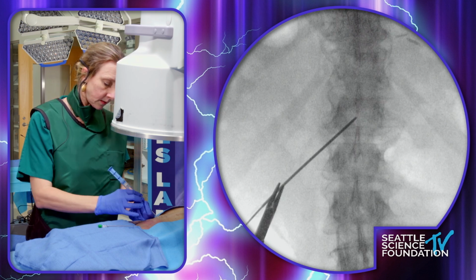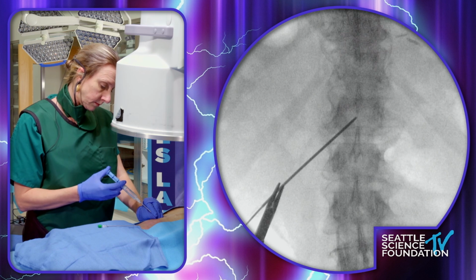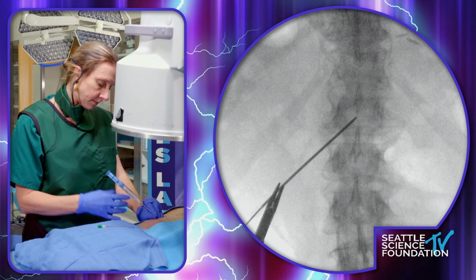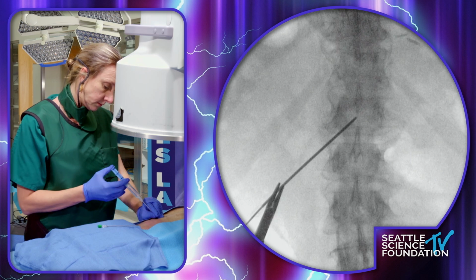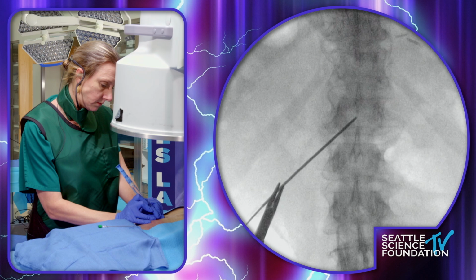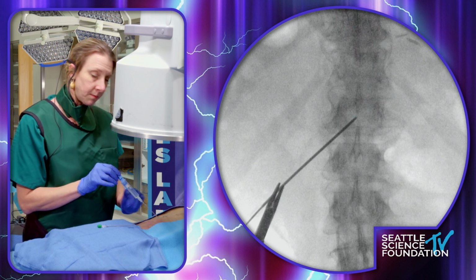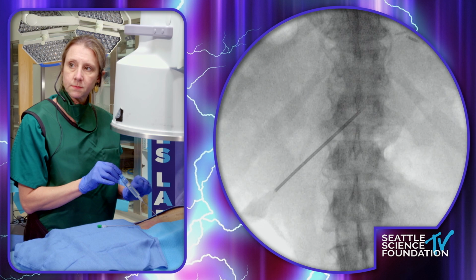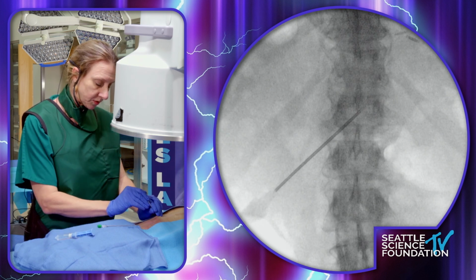And for those of you who use loss of resistance, a water-filled syringe is a very time-honored tradition. You can just use air. Do not use contrast. It's too sticky. So it'll dry out and become very difficult for you to pass any type of catheter or wire through the needle. So I have gone too far past the midline location, so I'm withdrawing.